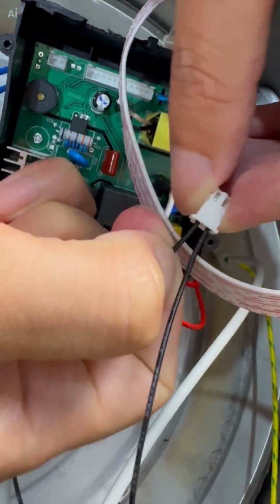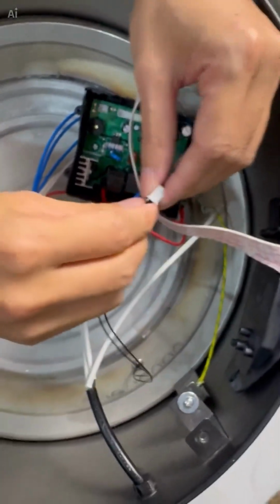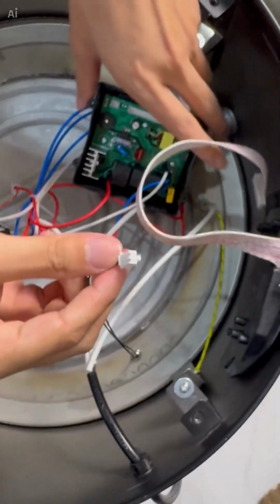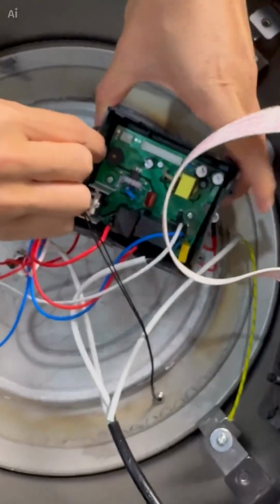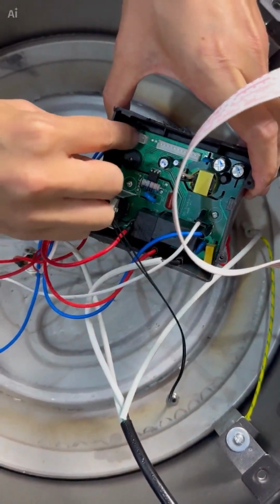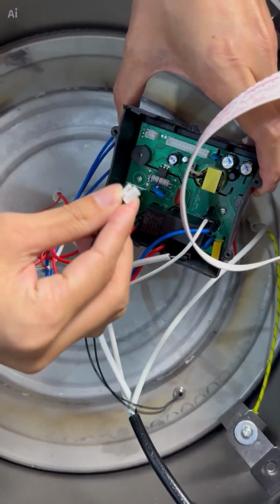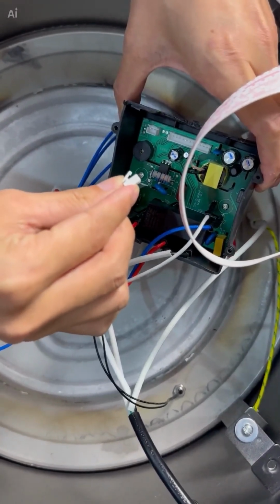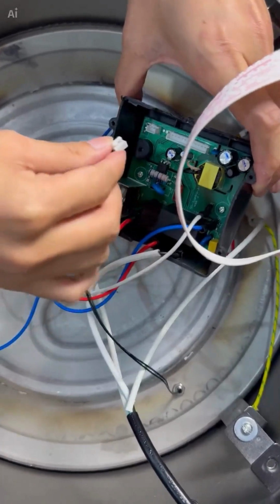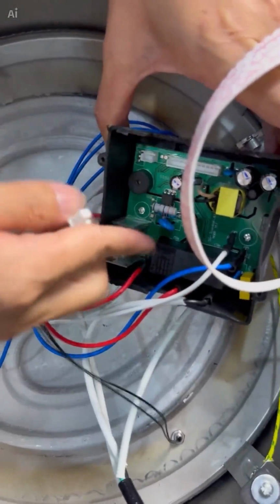Okay, now the connection of these two wires is complete, and this plastic terminal needs to be inserted into this terminal on the power circuit board. Then, with the clamping device on this end, insert it towards the end of the power circuit board.